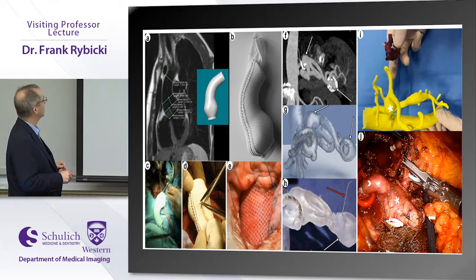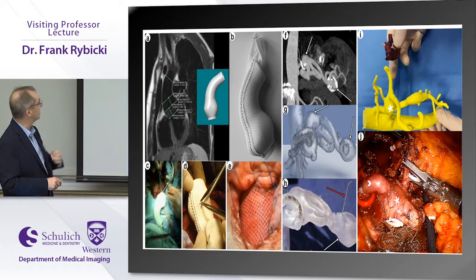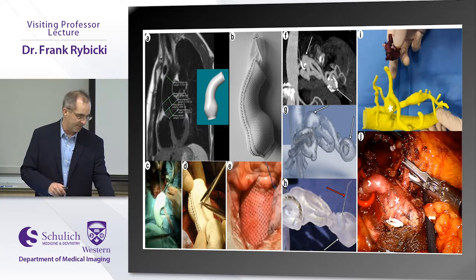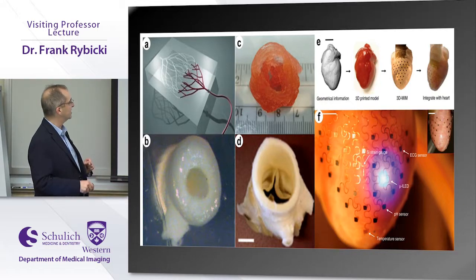With 3D printing, we talked a lot today with the residents about surgical replacement for aortic disease, aneurysm replacement, and 3D printing complex cases before you actually go after them. This looks like it's going to be some kind of weird splenic artery aneurysm. Before you clip it, you can actually do the thing. You can hook it up to the flow pump and do the hemodynamics. You can 3D print all kinds of cages and devices.